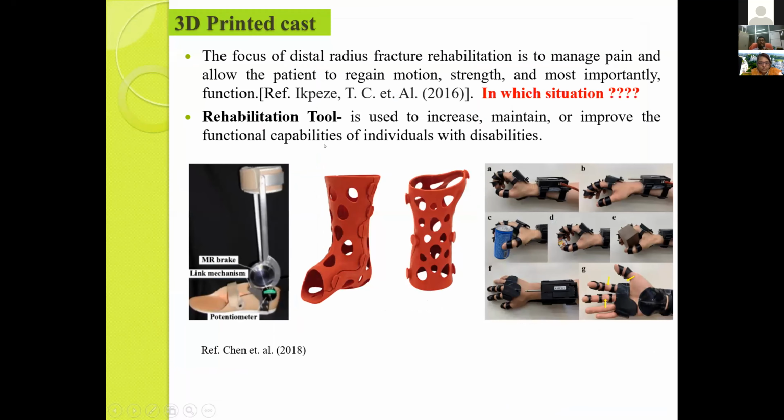The lab scanner covers not only the dental area. We can scan the leg or foot, or make an orthopedic cast for other treatment for orthopedic surgeons, for treating or rehabilitation purposes for the foot or for any grasping things. So we can create all those things.